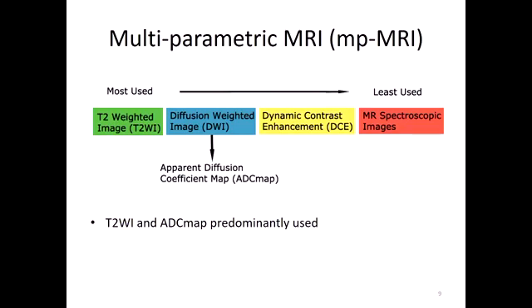One of its problems is that it's not very good at detecting tumors in the central zone and transitional zone, which we saw in yellow and green on the other slide, because the water content of healthy tissue in those zones mimics what a tumor would look like.